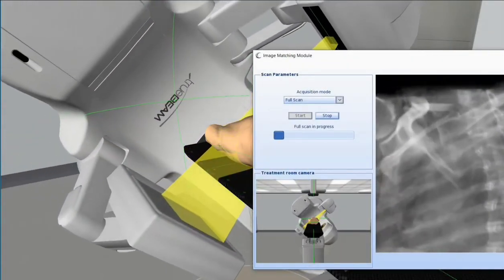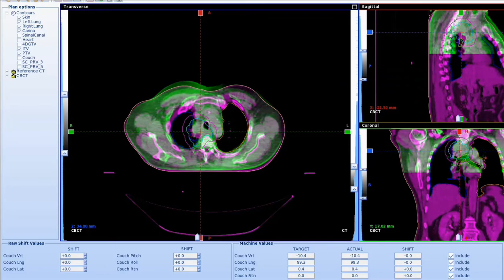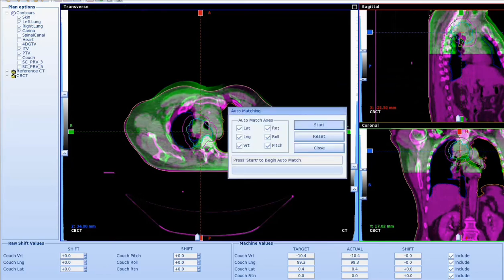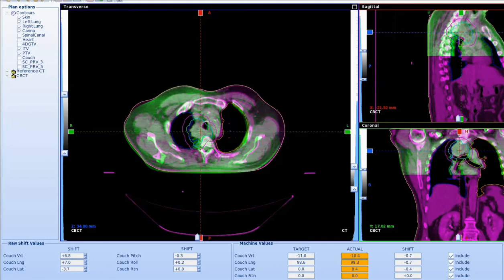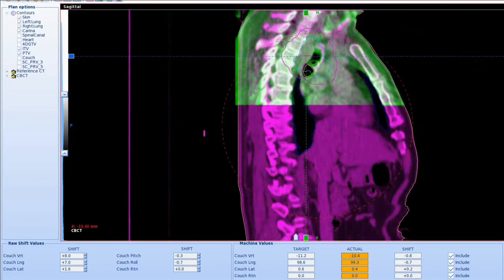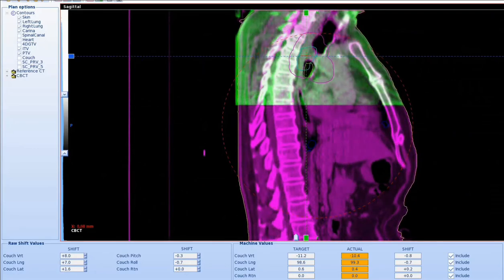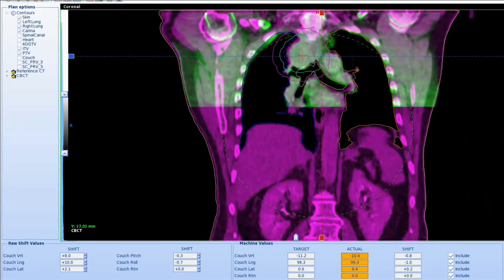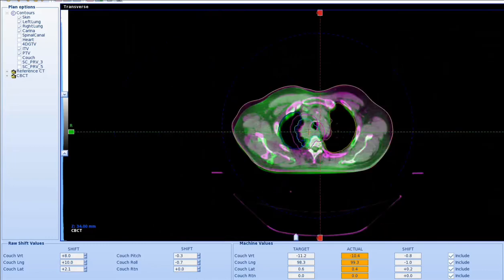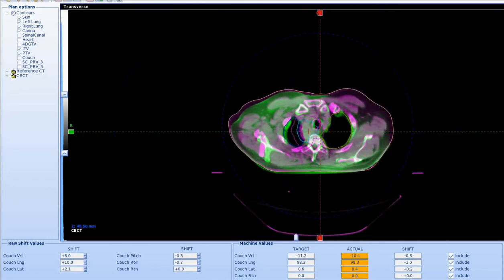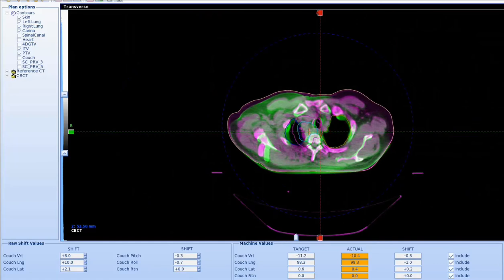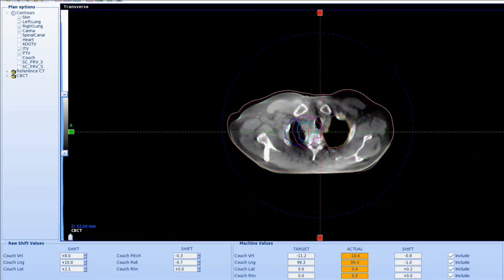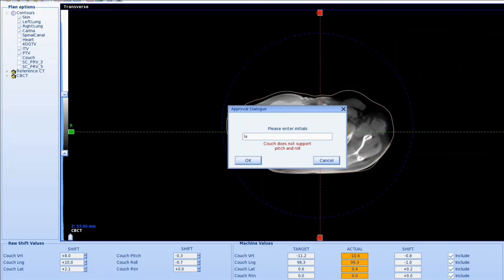The VIRT software has an image matching module which can guide the audience through onboard treatment verification. The software comes with five body sites, each containing four CBCTs, to allow students to practise their matching competencies. You can also import your own CBCT images from the clinic to expand your test cases. The module can also reassure patients they are receiving optimum treatment and educate patients who do not conform to protocol about the associated dangers.